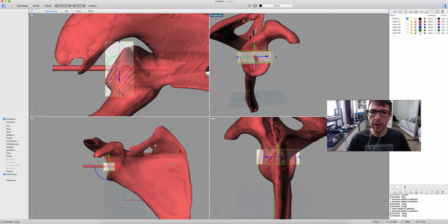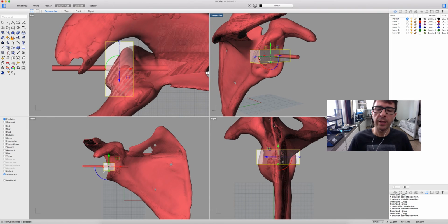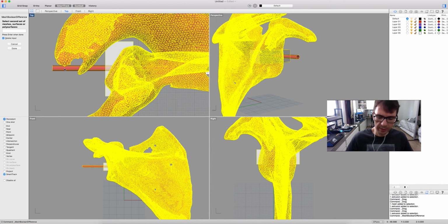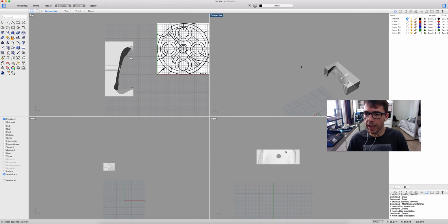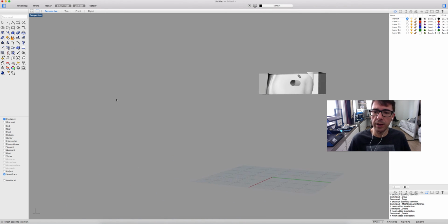Let's move, and here we have the central pin guide and the design we have just placed. So let's check the box. Let's select Boolean operations difference. Let's select our scapula and our central pin guide and hit enter. And here we have our central pin guide, as you can see here, that will fit perfectly into the scapula and shows us the direction for our central pin guide in reverse total shoulder arthroplasty.